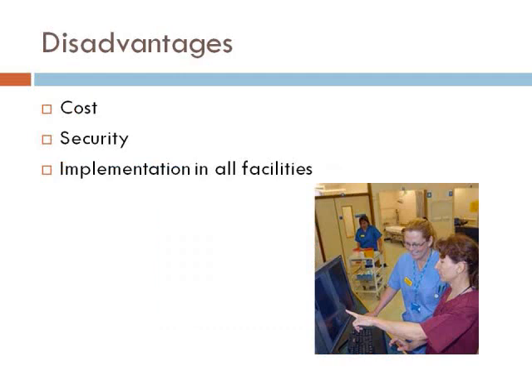Definitely the number one disadvantage would be cost. It is very hard with technology to implement new technologies because of the cost factor. So that would be a worry, that because it has such a high upfront cost, it will be hard to implement and encourage the use of PACS in all the hospitals.